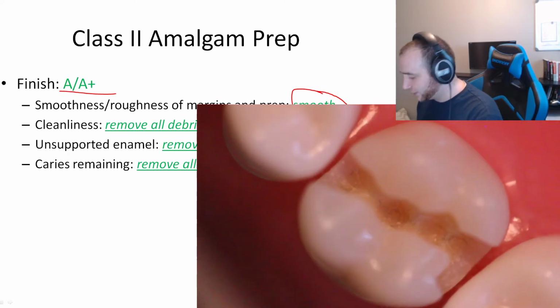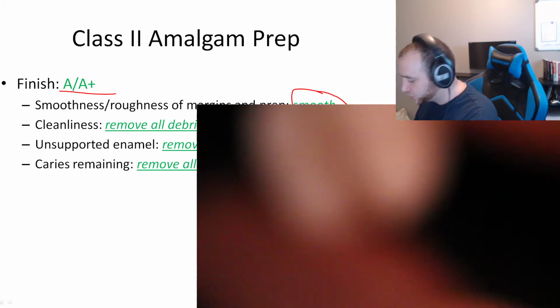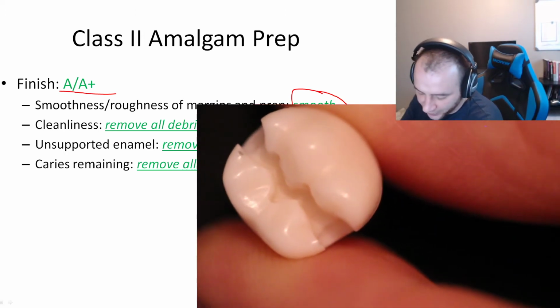If we take that other angle there, sorry, that other tooth, I keep losing this one. There it is. This one here. So you want to make sure you remove the unsupported enamel. Now, one thing is, don't try doing it with a hatchet.